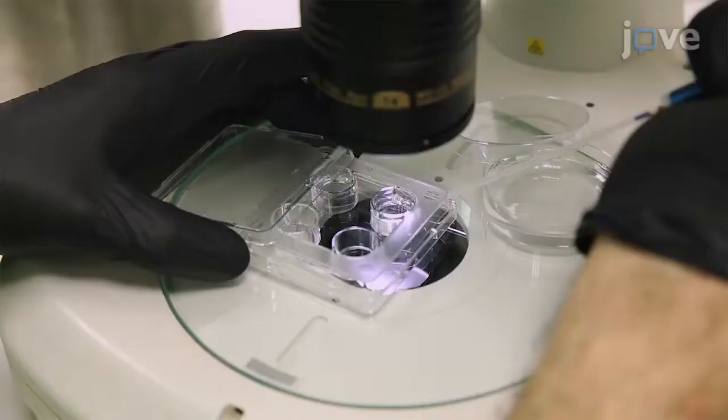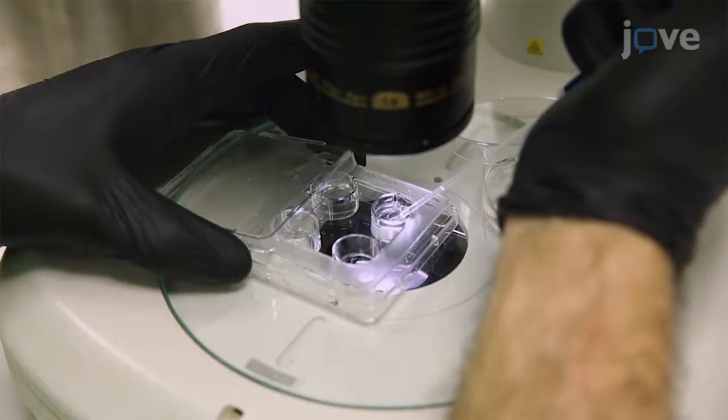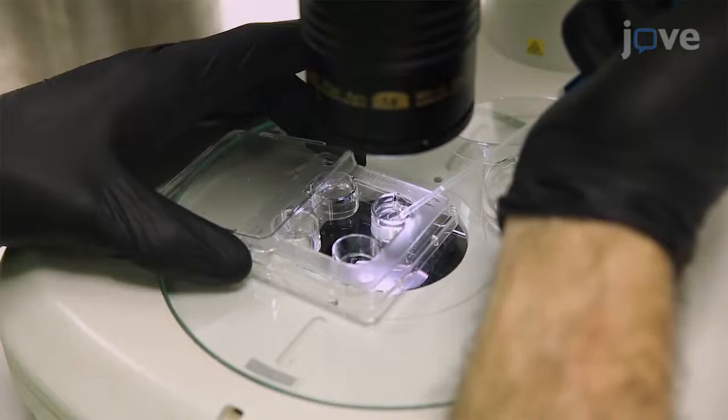Aspirate base medium up to one third of the straw length, followed by a small air bubble. Next, use a stereo microscope to aspirate the embryos in 40 µL of vitrification solution, followed by another small air bubble and enough base medium to move the first liquid fraction up to the cotton of the mini straw. Then, close the open end of the mini straw with a straw plug, plunge the mini straw directly into liquid nitrogen to achieve vitrification, and store the mini straw.